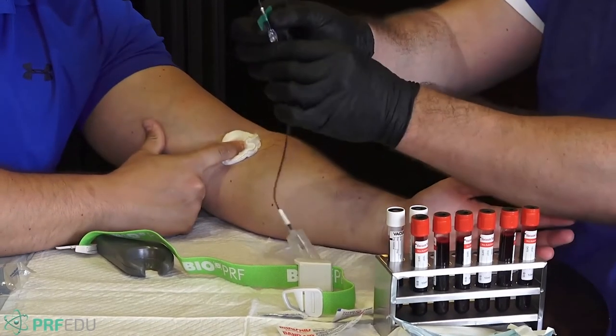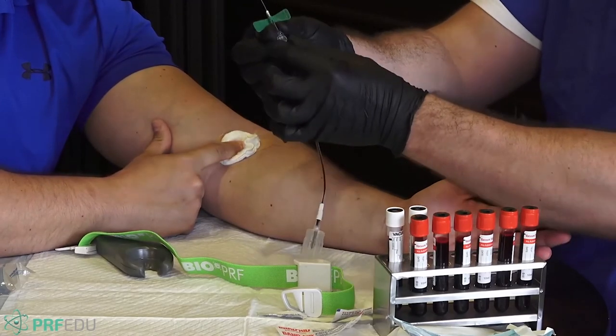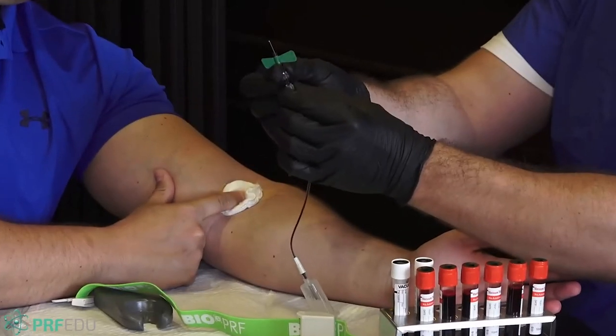Okay, with the butterfly needle right here, there's a little safety feature. You click both of these and you pull down. So that right there is the entire protocol in a video of me doing a blood draw. You can see that we do a very step-by-step approach towards doing this.